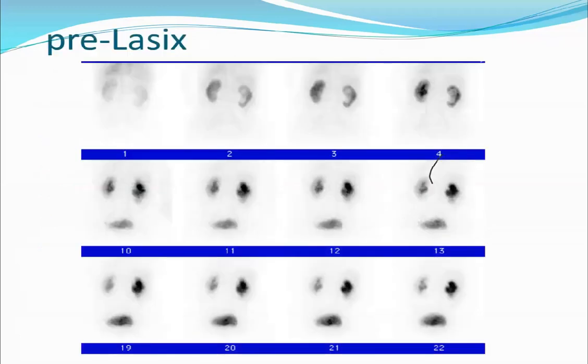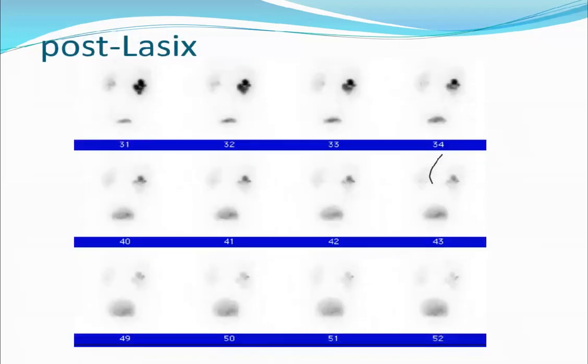This is an example for a case where the right kidney, as we see here, showed reduced perfusion and tracer uptake and delayed excretion with tracer retention along its pelvis. So we inject Lasix, and this is the effect of the Lasix. Here is the retention. After injecting Lasix, there is complete washout. So it is a dilated non-obstructed case.